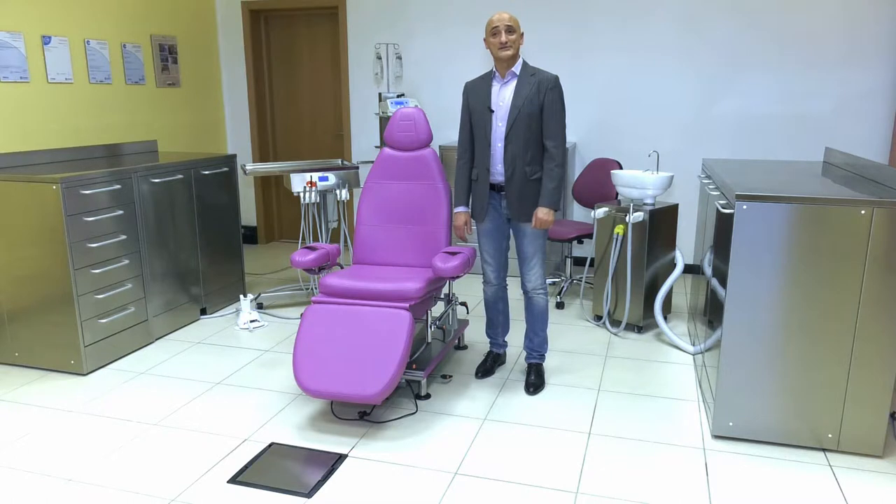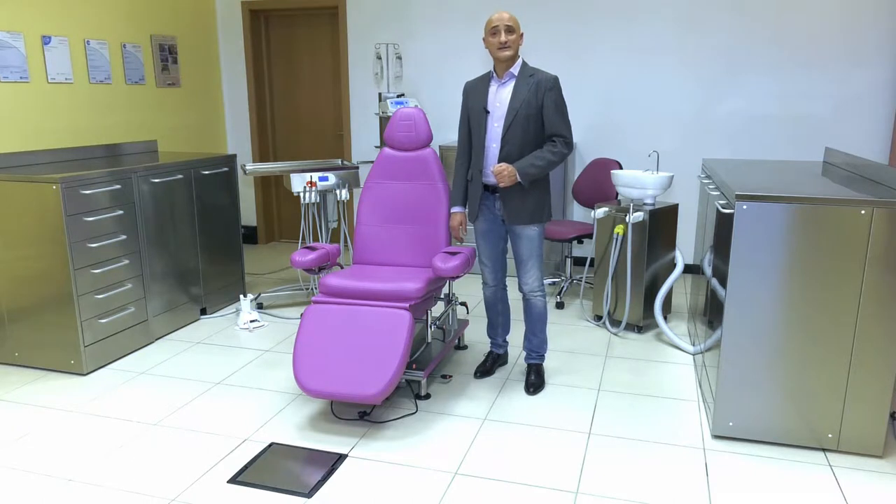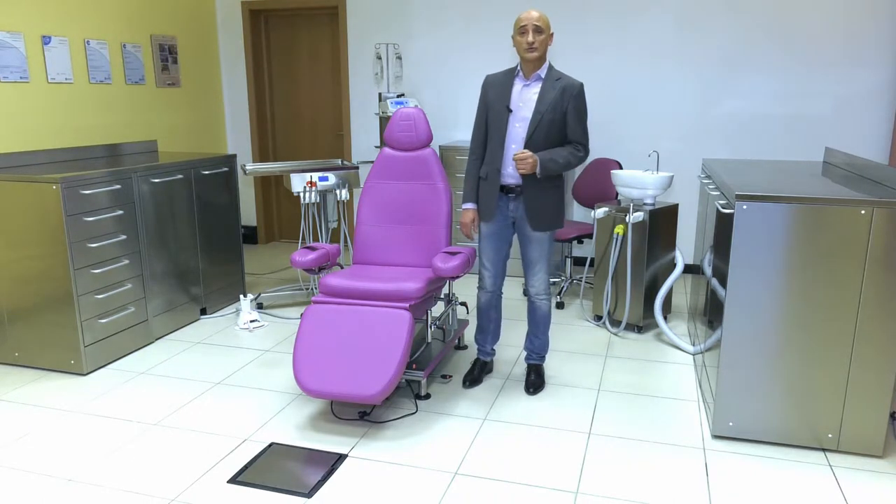Hi, I'm Michele Cirillo, product specialist for the handy surgery line by Technomed Italia. I am pleased that you want to see the potential of our Morpheus surgical chair.